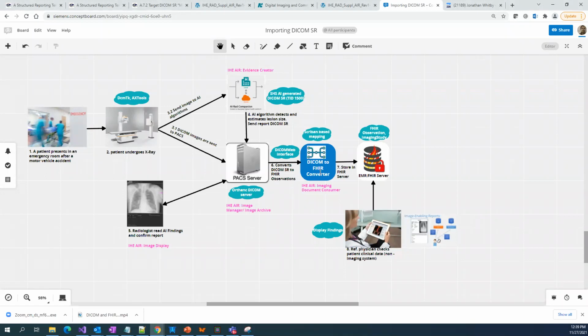This component, what we are going to develop, the DICOM FHIR converter, will talk to the PACS server to get the DICOM SR from PACS and parse it here. When we write the parsing logic here, there are two outputs. One is the Scriban template. The second one is the component which pulls via the DICOMweb interface. The DICOM SR it pulls feeds into this Scriban template, it generates, and there will be some more small component here which will push the observations to this part.